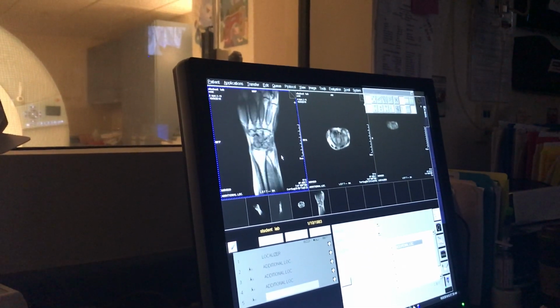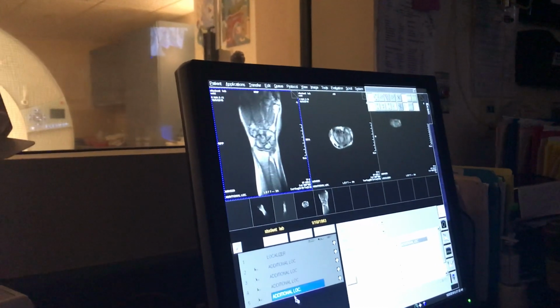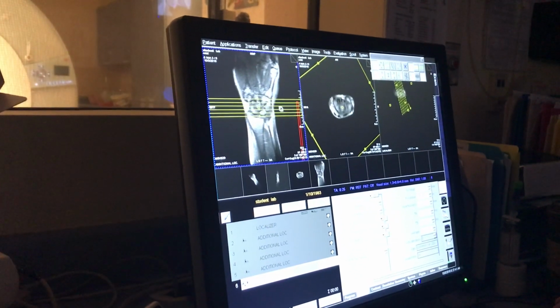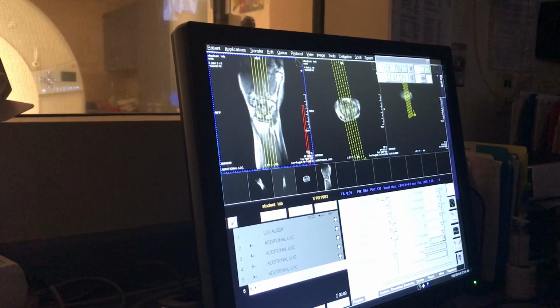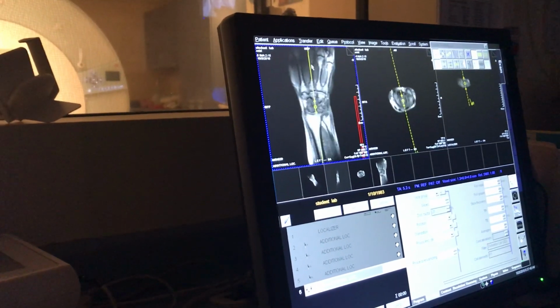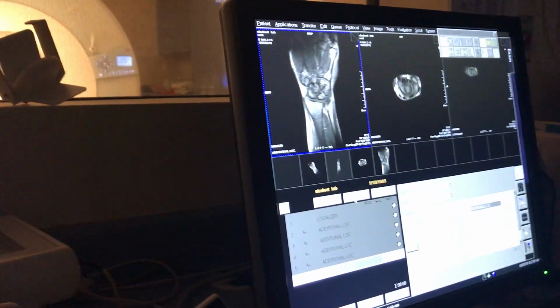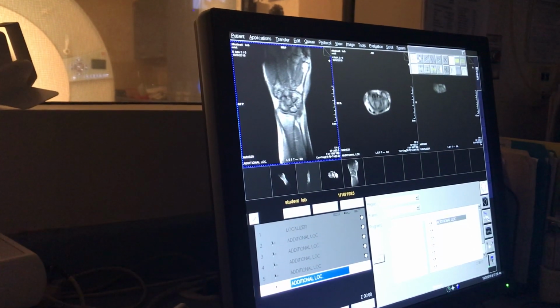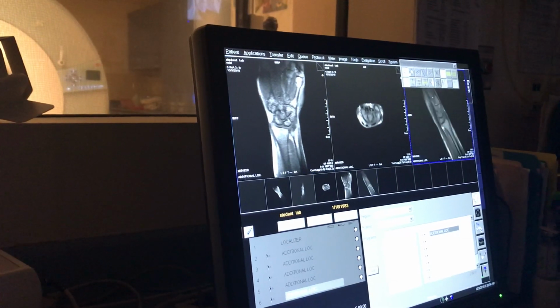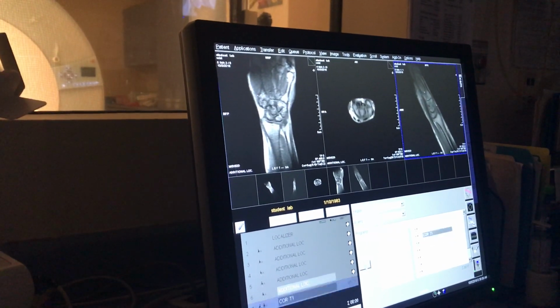So here we have a coronal localizer. We'll drag this group down one last time. Go perpendicular to the coronal. We don't need all these slices because we really just want one localizer for our second localizer field of view later. And run that. So now we'll have a coronal, an axial, and a sagittal. So now we can prescribe our first coronal series.